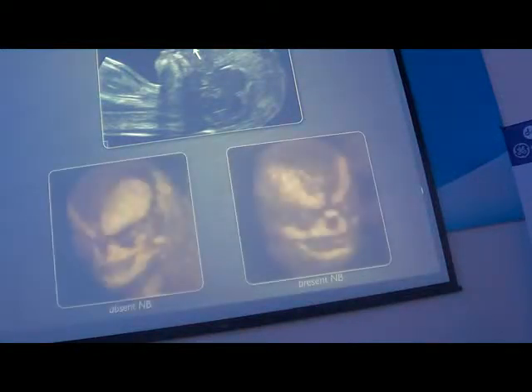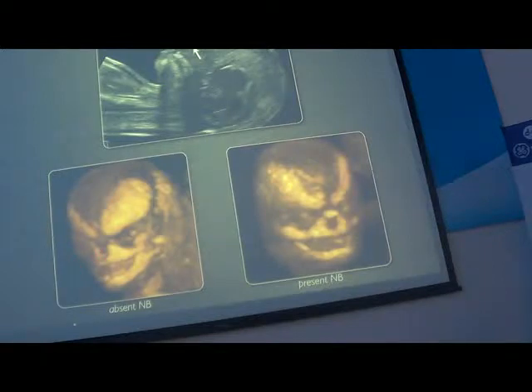And this is the nasal bone with 2D. Here is the 2D image showing the nasal bone. And with the maximum mode, two fetuses, one with a normal nasal bone here, and the other one with absent nasal bone. With the maximum mode, on the right you can see the nasal bone here, while on the left the nasal bone is absent.